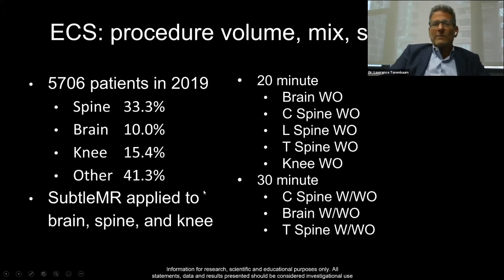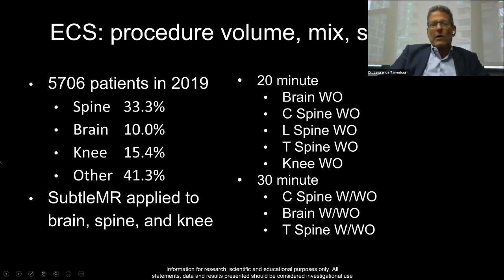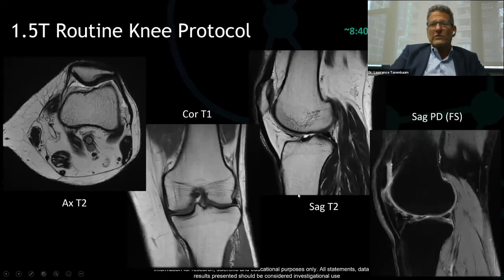Now, here's one of our East Coast pilots. This particular pilot was a bit affected by COVID during this trial. You're not seeing quite as much of our imaging falling into the typical outpatient imaging realm. But even in this trial, we're still 60% applicable to what we can cover with the deep learning software from Subtle. You notice in the East Coast, we were already at 20 and 30-minute slots. Here you can see what the knees look like at 8 minutes and 40 seconds. With all the usual suspects, and you can see that even though we've achieved quite a bit of acceleration with our protocols, we're still able to maintain the image quality.